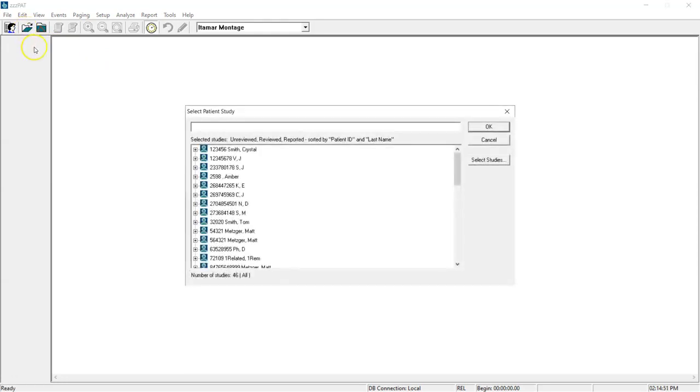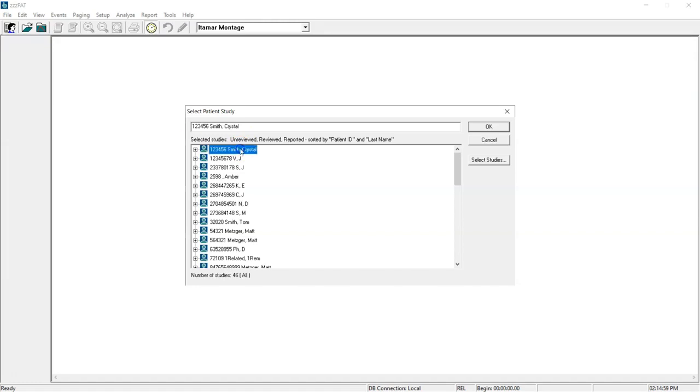I'll open my studies and find the patient that I want to do the interpretation on. In this case, it's Crystal Smith. I double click on her name and then double click on the test.